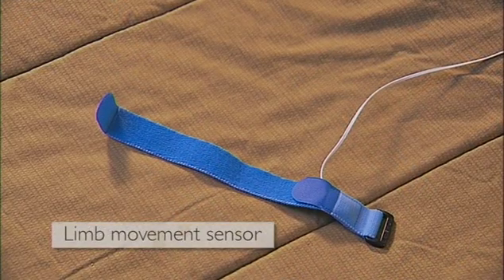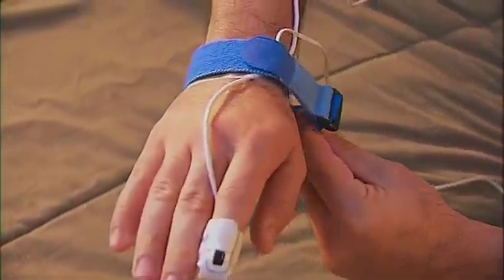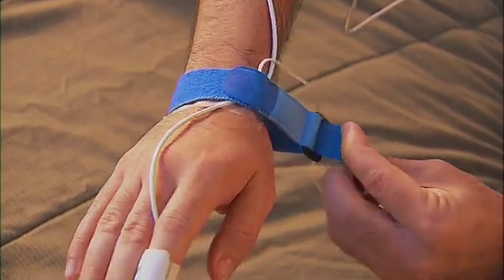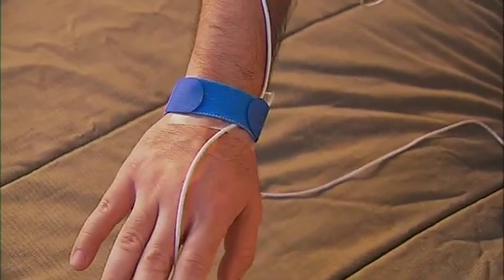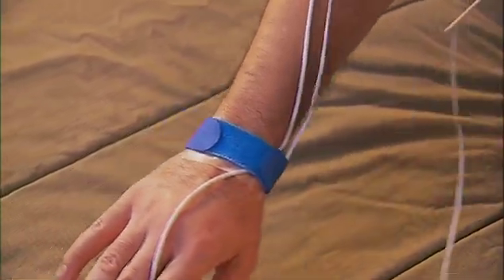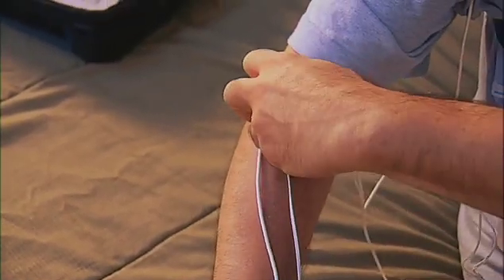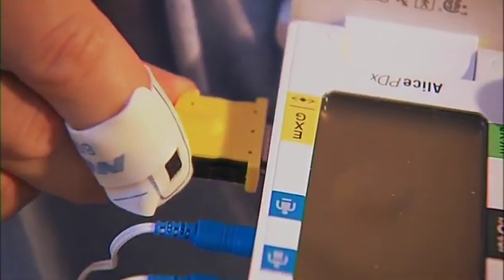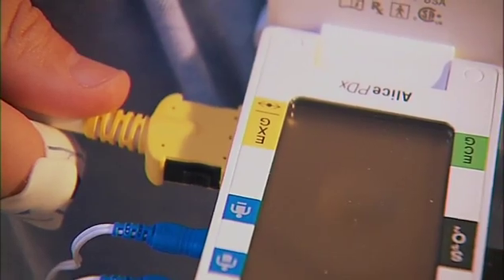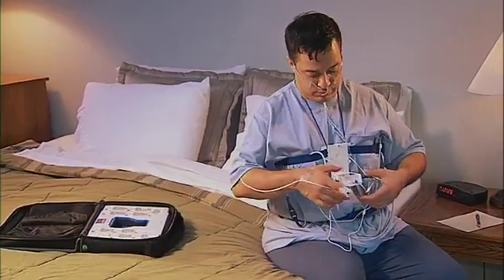The sensor display should stop flashing after about six seconds. If your provider included a limb movement sensor for your study, apply it now by wrapping the cloth fabric around your wrist and inserting the strap through the black plastic clip. Wrap the rest of the strap around your wrist and secure the wire with a piece of tape applied on your forearm.